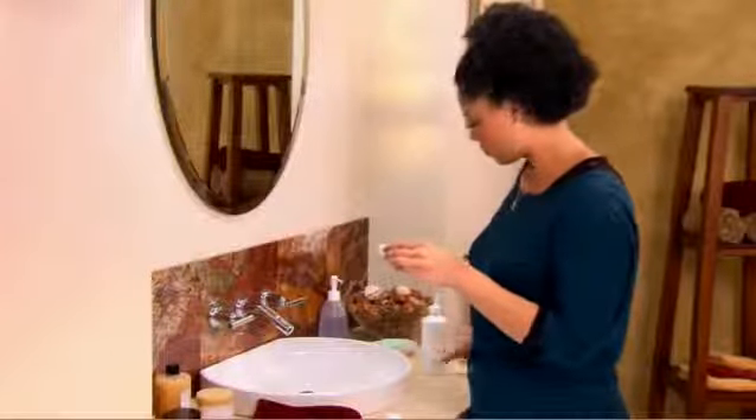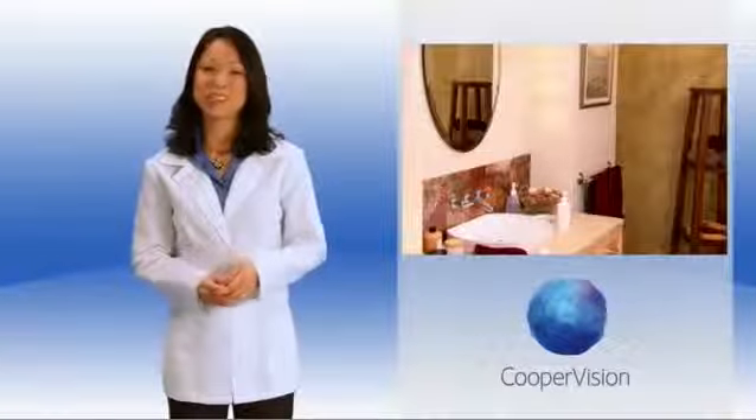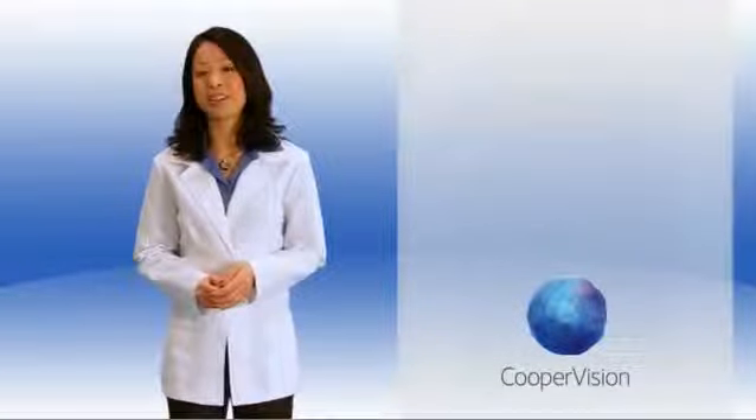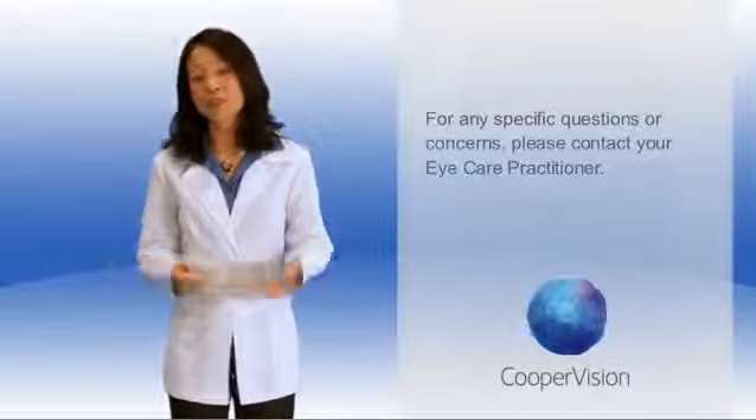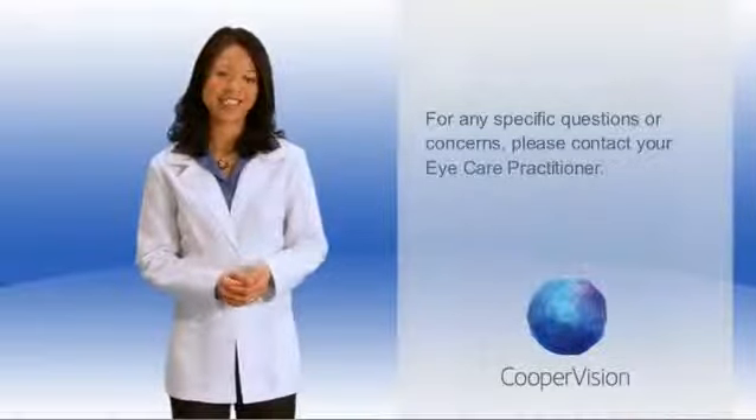Follow the same steps to remove the lens from your left eye. That wraps up the CooperVision Contact Lens Application and Removal Tutorial. Remember, if you have any questions regarding your contacts, check with your eye care practitioner. Thanks.